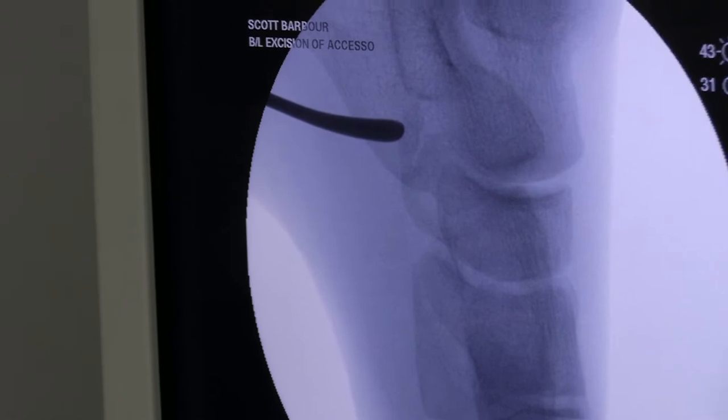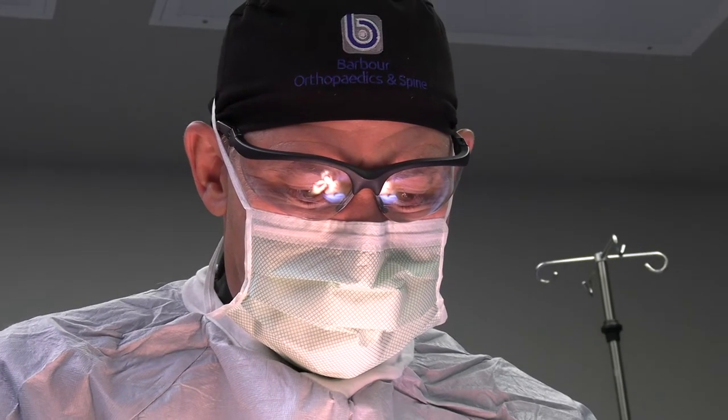We're just going to go in and remove it. This is going to be like kind of taking a pebble out of the shoe, and once he recovers, his pain should resolve.